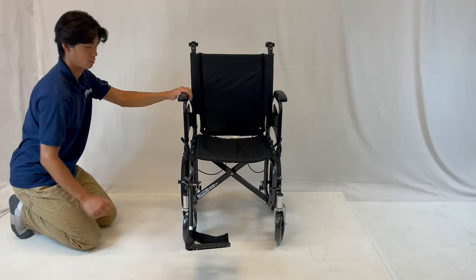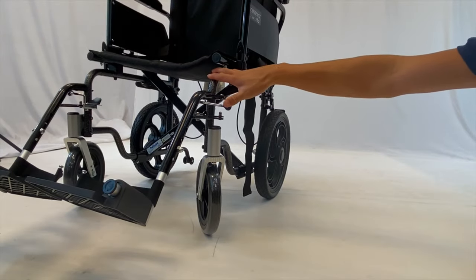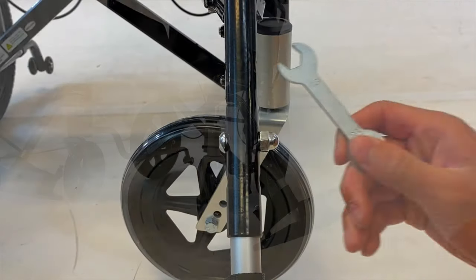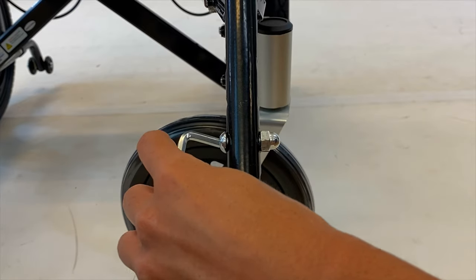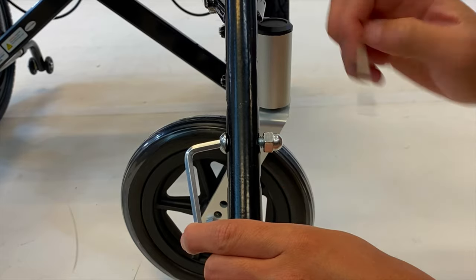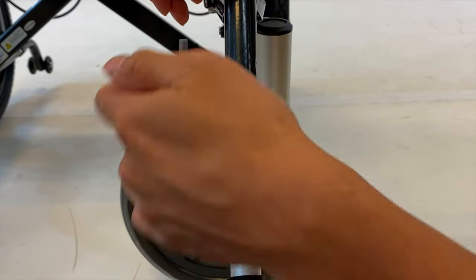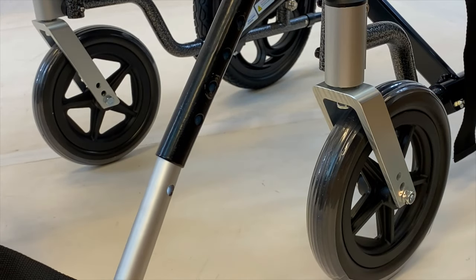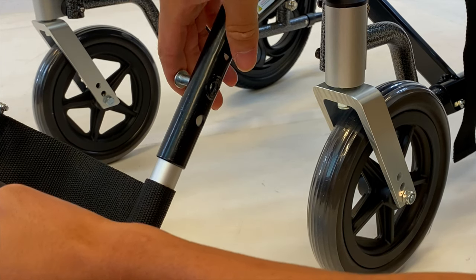Latch the leg rests on by aligning the holes on the leg rest with the buttons on the wheelchair. Pull on the lever near the leg rest to move it out of the way. To adjust the height of the leg rest, use the size 13 wrench and allen wrench provided to open up the nut. Align the leg rest with the corresponding length that is desired, then using the tools provided, put the screw and the nut back in.